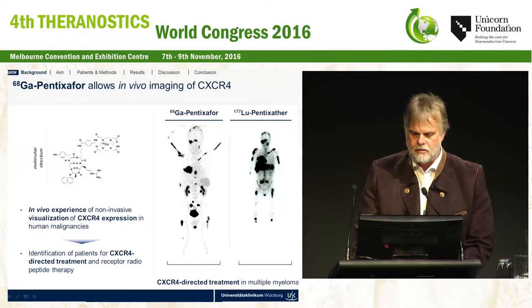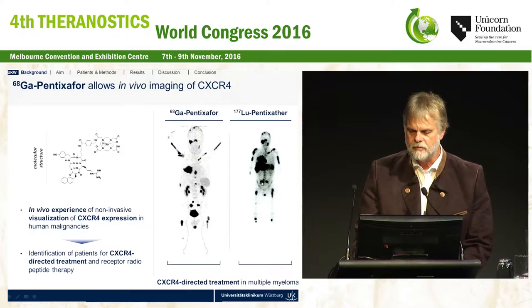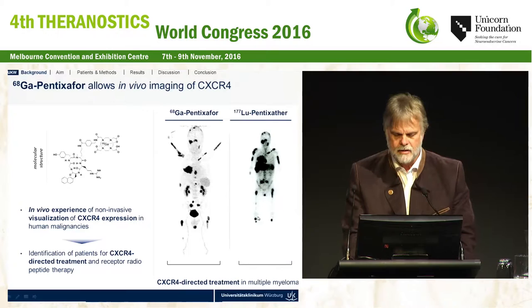Here you see on the left-hand side the gallium 68 pentixafor scan of this patient. And on the right-hand side, you see the same patient after the first cycle of treatment. You can see that the lesions also show up with pentixatherapy. I also want to remind you that pentixafor and pentixather are slightly different chemical entities, but the biokinetics are quite similar.